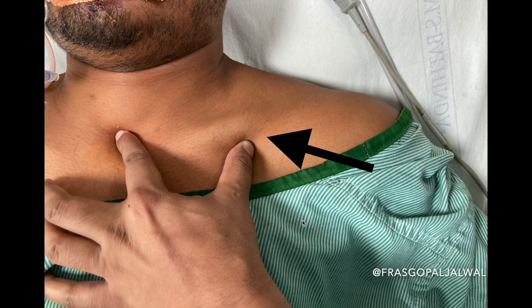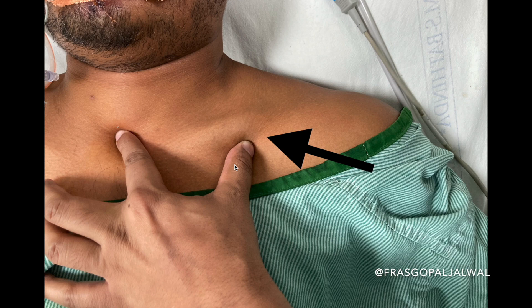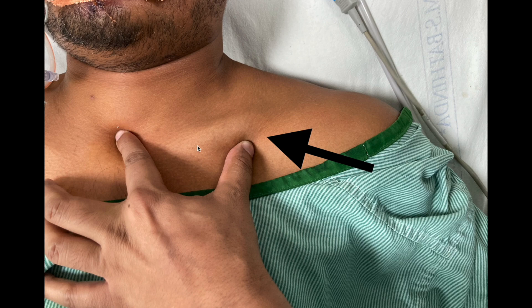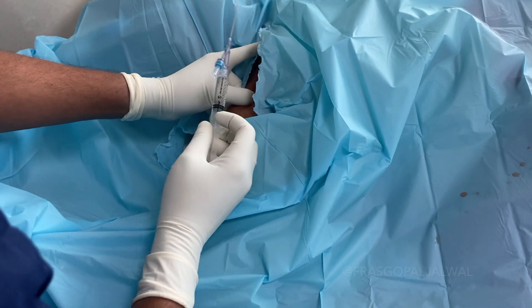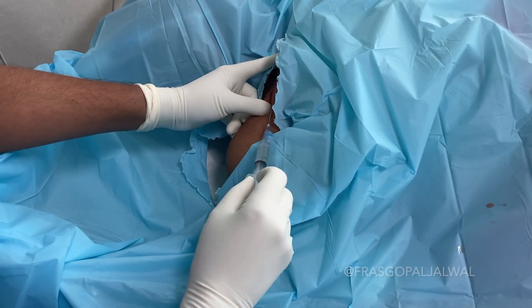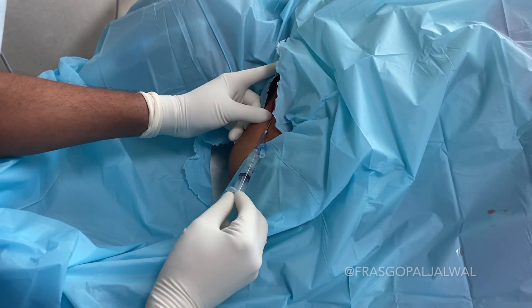The next step is to place your index finger at the suprasternal notch and your thumb below the lateral one-third of the clavicle. You then take the puncture needle and insert it just below the lateral one-third of the clavicle near the thumb, directing it toward the suprasternal notch. Here you can see my index finger is at the suprasternal notch and thumb is below the lateral one-third of the clavicle.